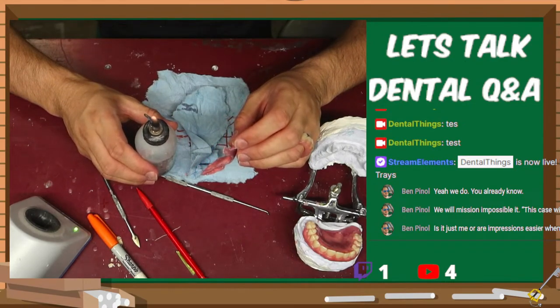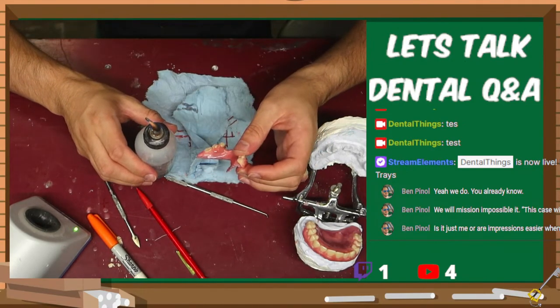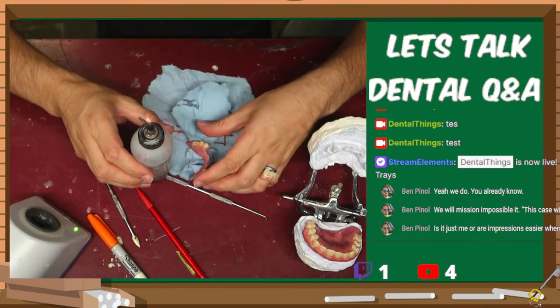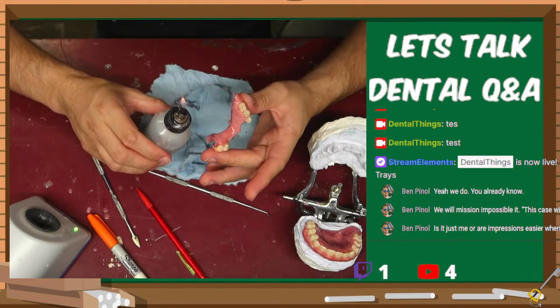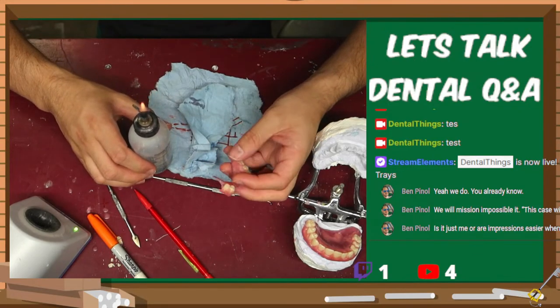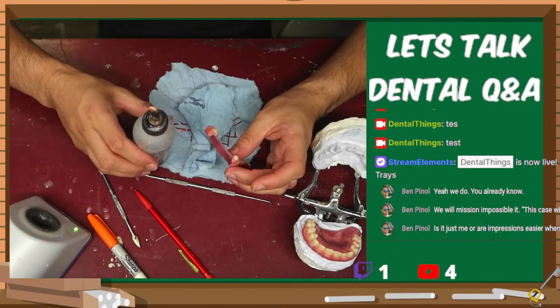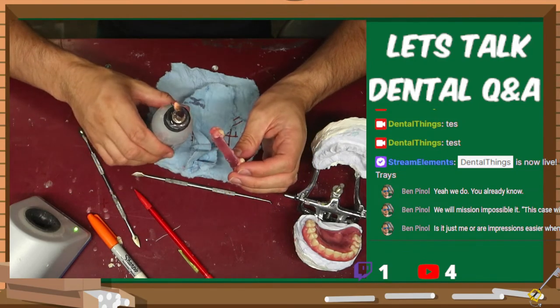Is it just me, or are impressions easier when there are teeth present? It's nice when the teeth are actually there when you're taking an impression, because you have something to guide yourself up in there. Unless you're super trying in the trays beforehand on an edentulous patient, and you're super certain this is going to go in this direction. I just need to make sure I don't slip it off to the left or to the right. They're not too bad, but I'd rather them have a tooth or two to help guide me, and also act as little stops, because then I'm just pushing it right up against the gums.